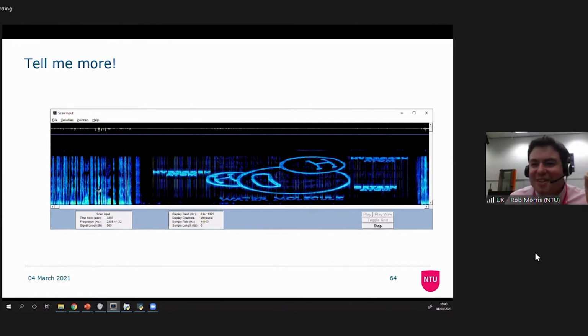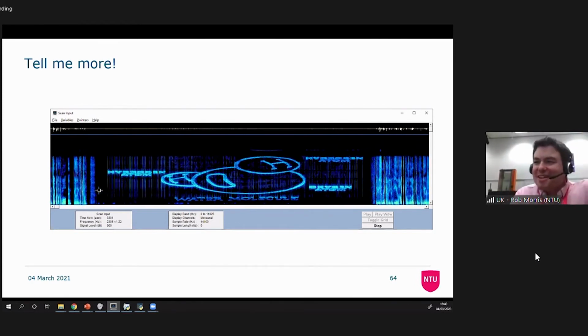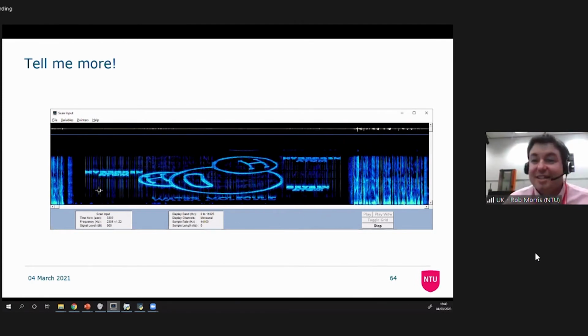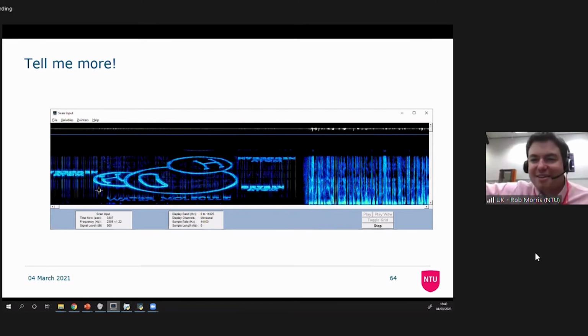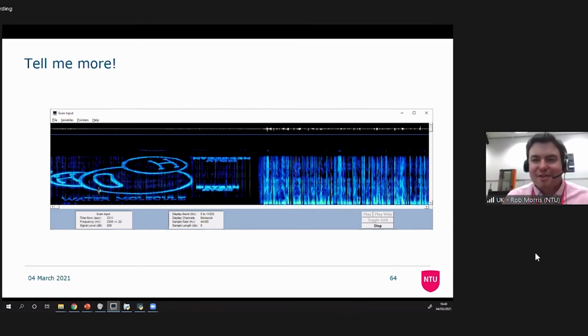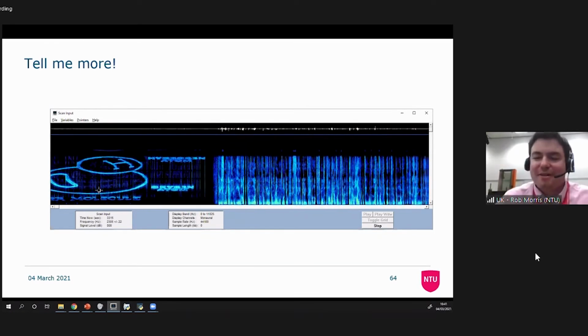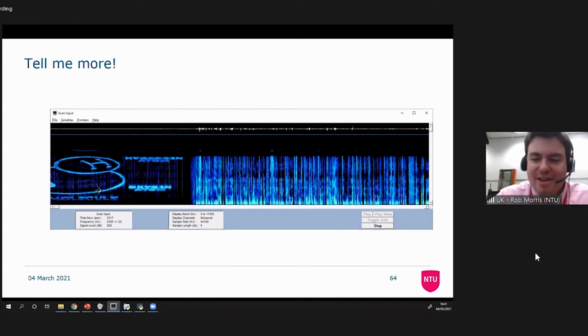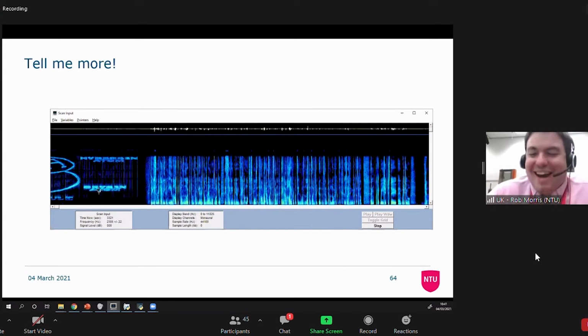If you listen really carefully, you can hear the high pitch ones and the low pitch ones coming together as it comes around the water molecule. And it's the same thing that we're doing. So if you've got lots of signals at the far right hand side of the scanner, they're going to have a higher frequency than the ones at the left hand side of the scanner, which have a lower frequency, at least on everything we've looked at so far. Okay, we'll do two more. I can't help myself, I'm sorry.